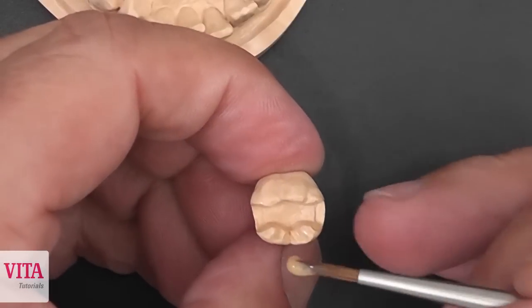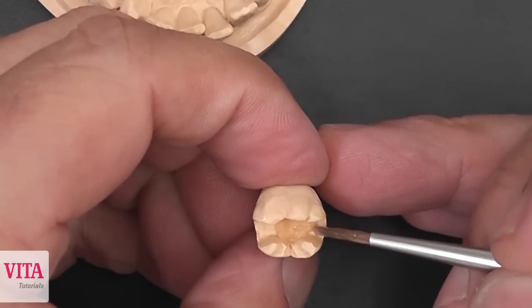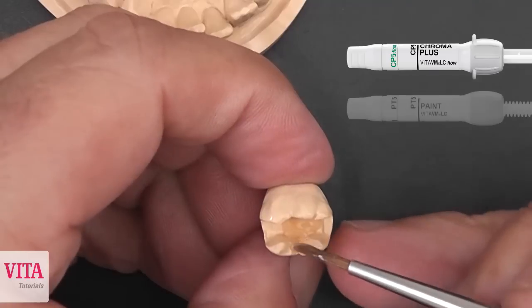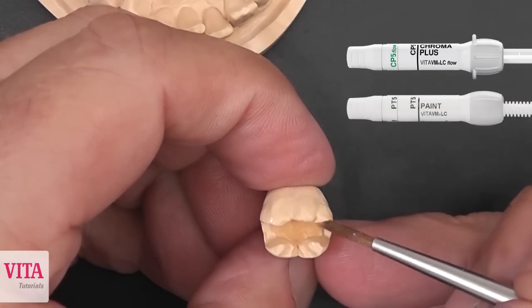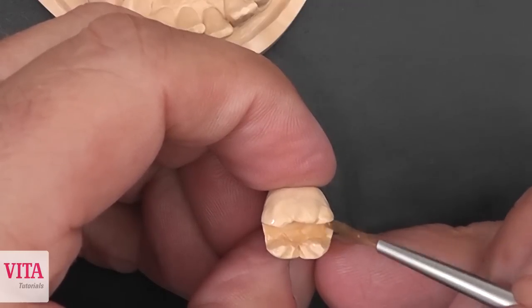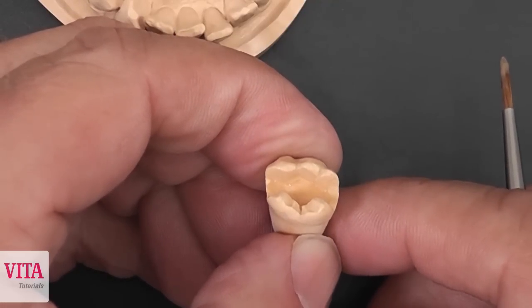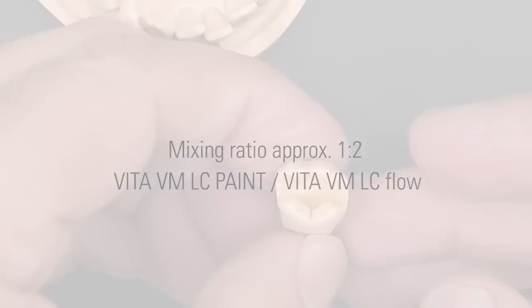In the second step we create the first base of the inlay. For that we use CP5 and we add a little bit of paint 5. We mix it together and then we apply that on the base of the inlay to get a more chromatic color from the inside.